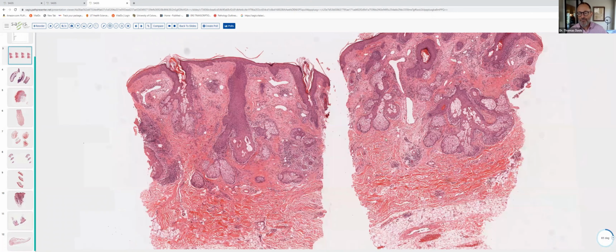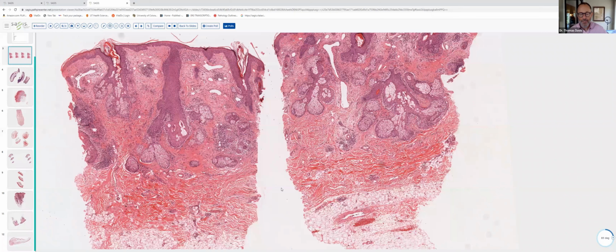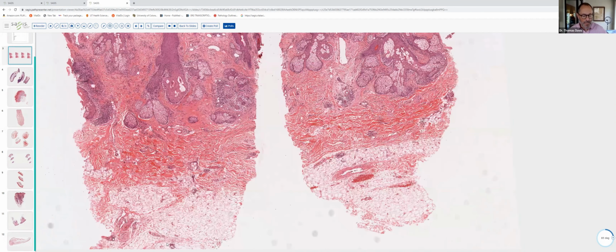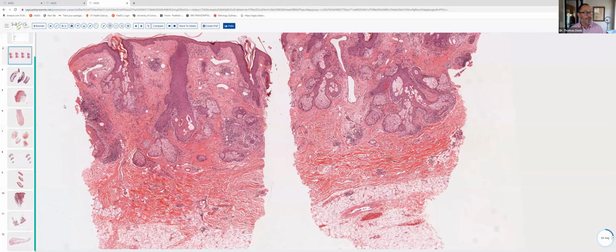And note these hair follicles are a little miniaturized, vellus, and they're not embedded in the fat. If we had these same changes, as we'll see in a subsequent slide, and the hair follicles were larger and embedded in the fat, then we would be dealing, in particular, if it was from the face, with the bearded area of a male, or with the scalp. So this is facial skin.